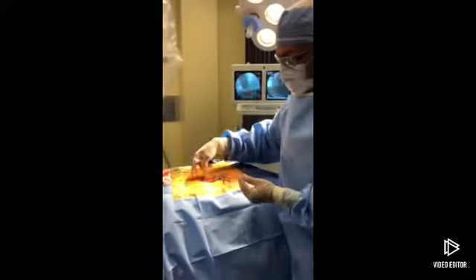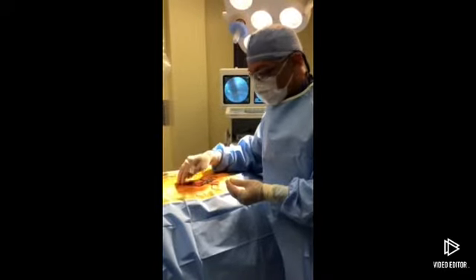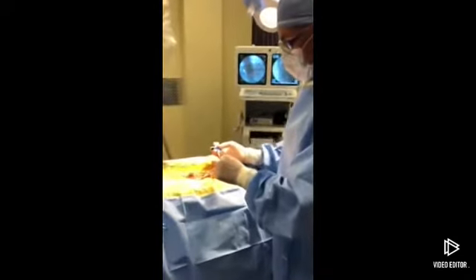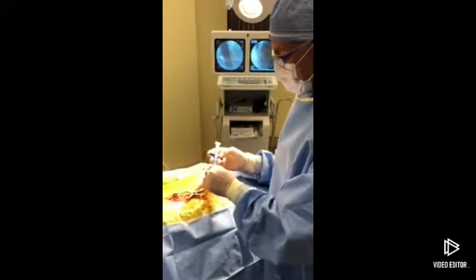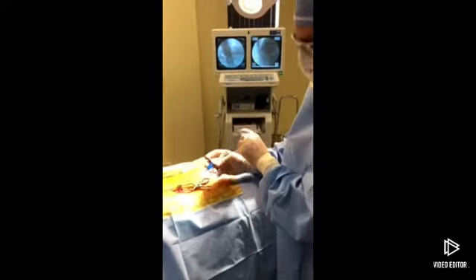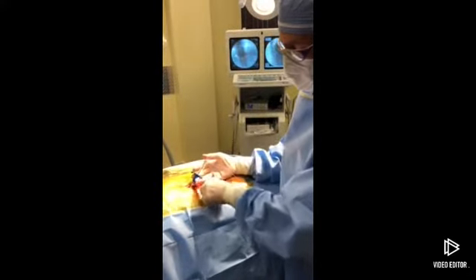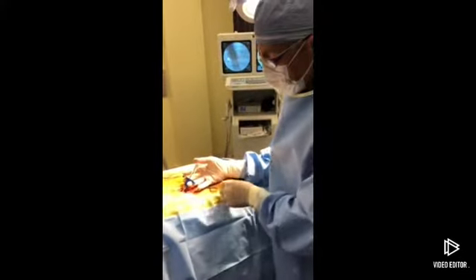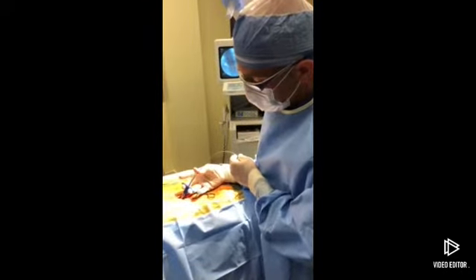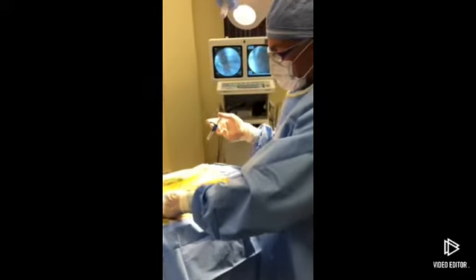The wire is entering her epidural space further down and then residing up about here. Now I need to anchor this wire, or lead, down to her fascia so it doesn't get pulled out. There's a device that Medtronic has here, and we're going to slide this over the end of the lead. Simply slide it over here like this. It comes out, and then we advance it down. Slide it all the way down to here, and this anchoring device will cinch around the lead itself, and then we can just sew that down with some silk tie to the fascia. So we're going to go ahead and squeeze it right here, and then gently remove the anchoring device.